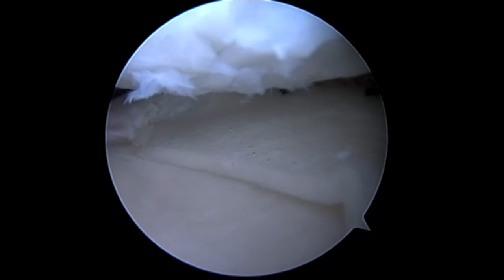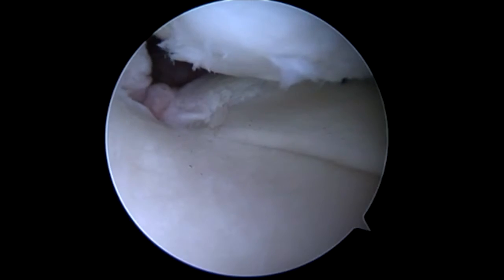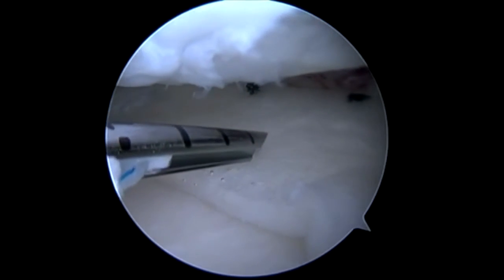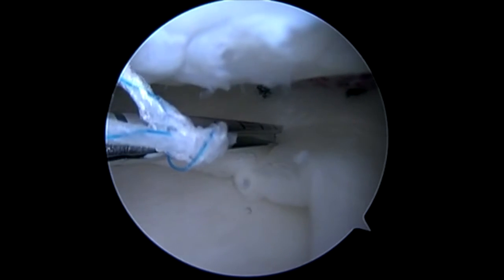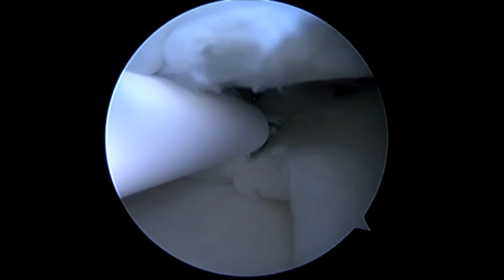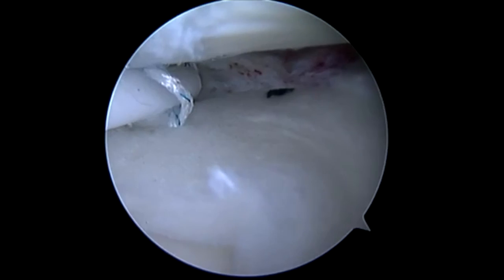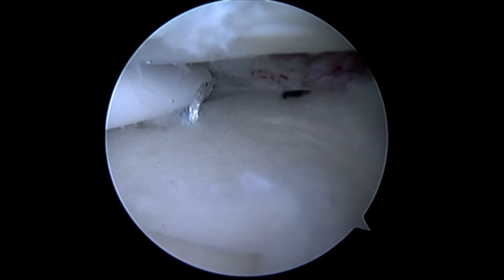Here you can see our CMI implant in place. Initially we were measuring our defect and then freshening our edges, and now we have our implant in position that we've shuttled into the knee. This is a Fast Fix 360 device, which is known as a meniscal fixator device. This allows you to penetrate through the CMI implant and deploy a small plastic T on the back side of the capsule, and then deploy a secondary T.